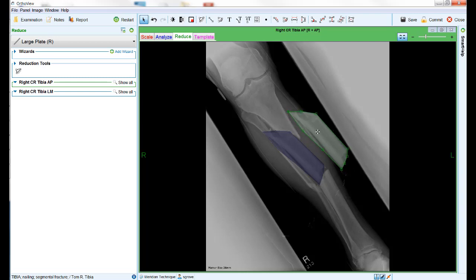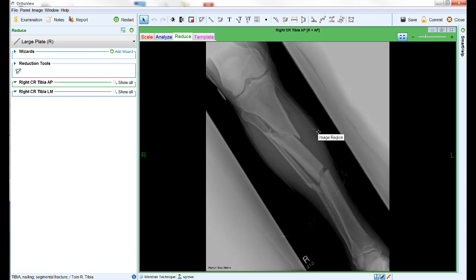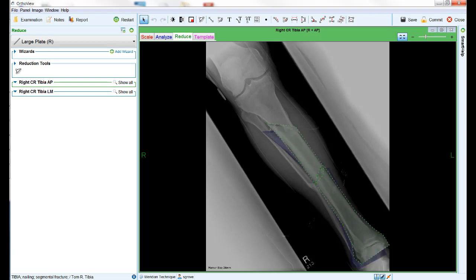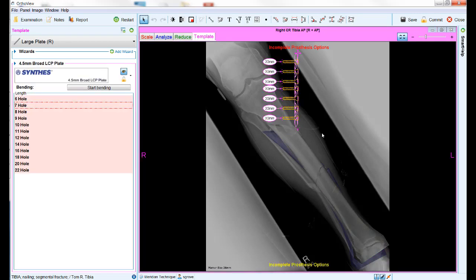The reduction tool can be used as many times as required to reposition multiple fragments and reduce the fracture ready for templating. You can also come back to the reduction tab as often as required to adjust the reduction once you have started the templating process.